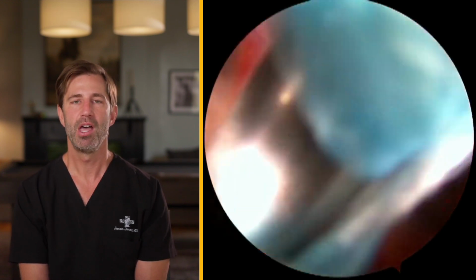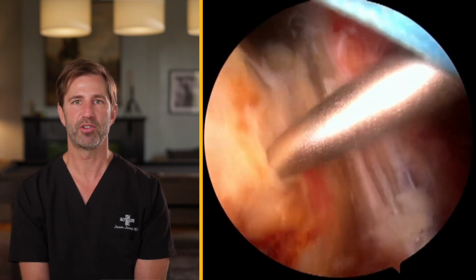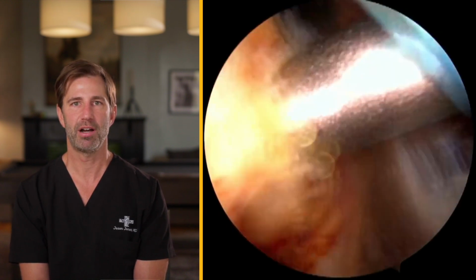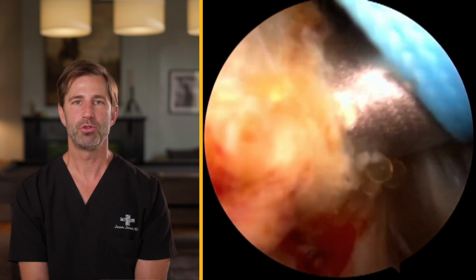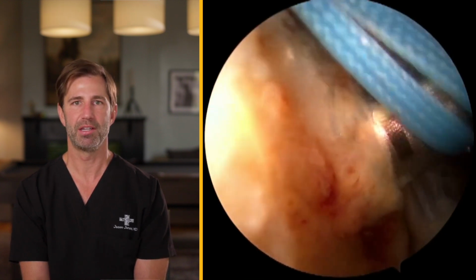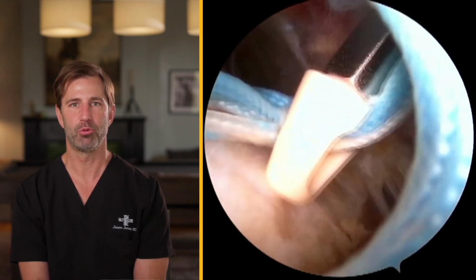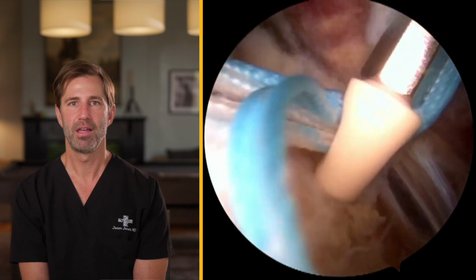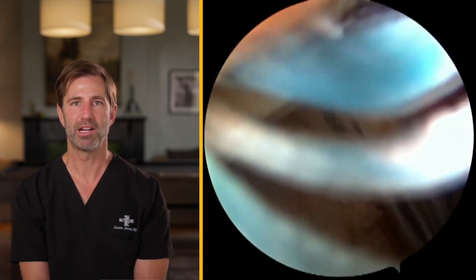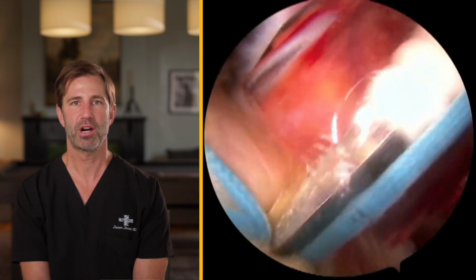This is a backup as well as a second form of compression that we can place across the rotator cuff. We're tensioning these sutures, which allows for the lateral aspect of the rotator cuff to be pushed down against the exposed bone. This also provides a backup if any of these sutures were to become loose or untied. We place 2 lateral row anchors in a crisscross type of fashion, which provides for maximum pressure on the outside of the rotator cuff.